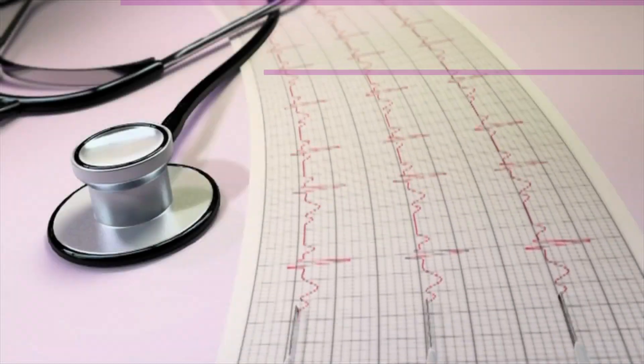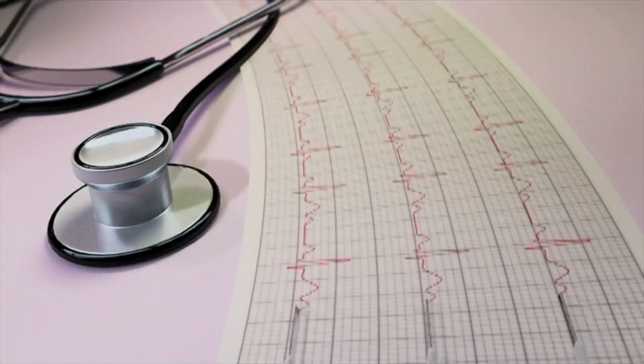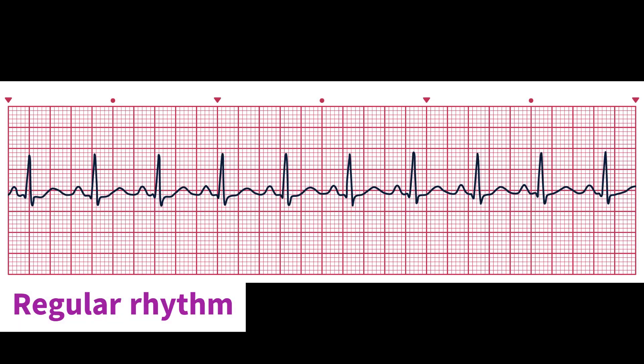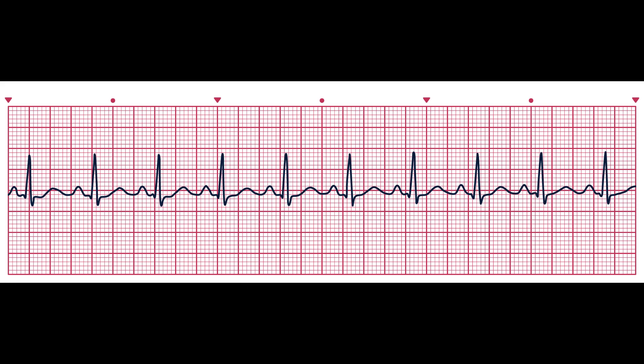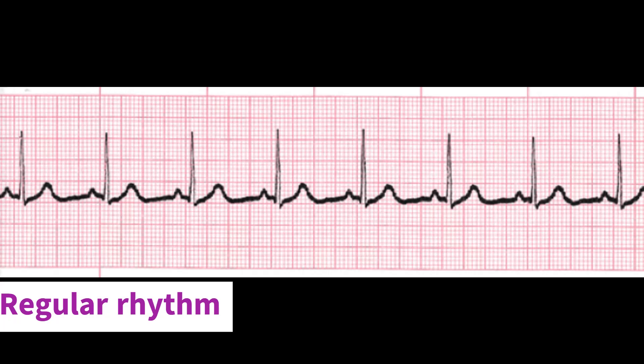Here are examples of regular and irregular rhythms. This is undoubtedly regular in rhythm. When you measure the R-R intervals from one QRS to the next, they are all equal and consistent. Here's another one which is regular.